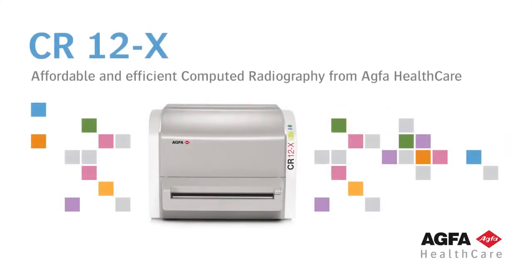CR12X is AGFA HealthCare's efficient computed radiography system that allows you to balance the need for high speed versus high resolution.